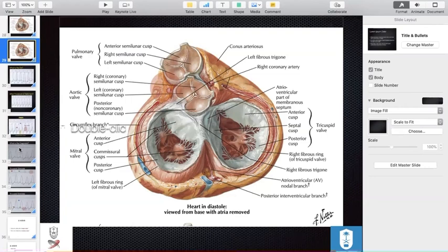Yeah, Dr. Waleed. So let's review again, if you don't mind. Sure. The steps again. So first, you identify if it's right ventricle or left ventricle, and you do that. Right. And you do that by how?